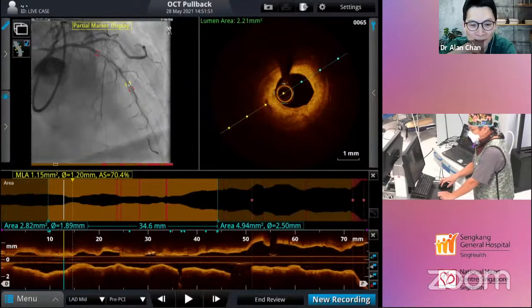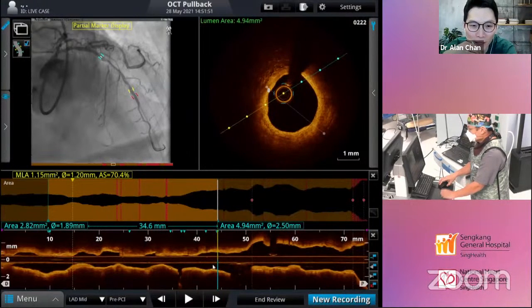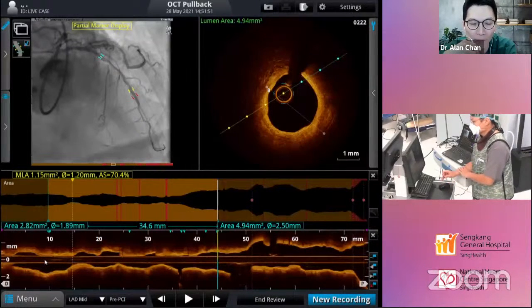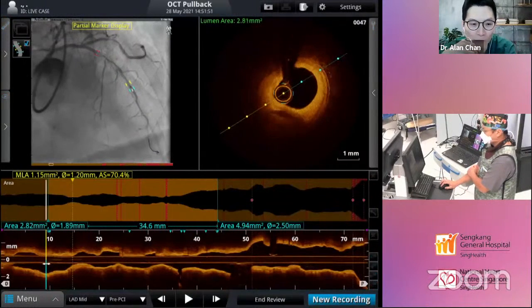Yes, I think this should be the most difficult thing for beginners using OCT to size the vessels. I think basically the MLD max are mostly based on the lumen criteria in using OCT to guide the PCI. So the key is that you need to identify both the proximal and distal segments, right? Identifying the distal segment is for us to judge the stent size. For challenging cases, for diffuse disease, sometimes it may be very difficult for us to get the right spot. I think this case is one of the cases where you can't really get a decent landing spot.